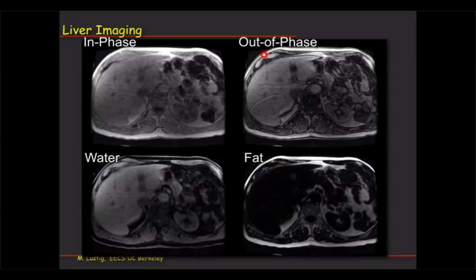Aliasing. It has this shape. So it's actually aliasing of this, and this is probably what's called parallel imaging. So this was accelerated using parallel imaging. We'll talk about it a little bit later. But if you accelerate, then sometimes you might get residual artifacts. And this is a very typical residual artifact.